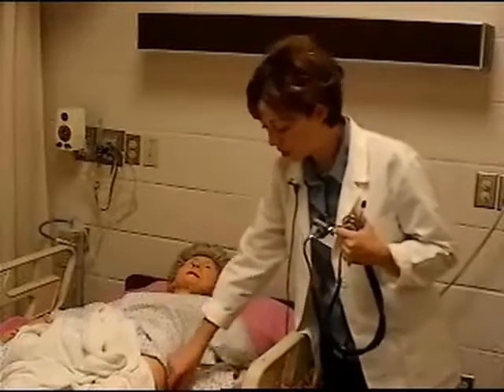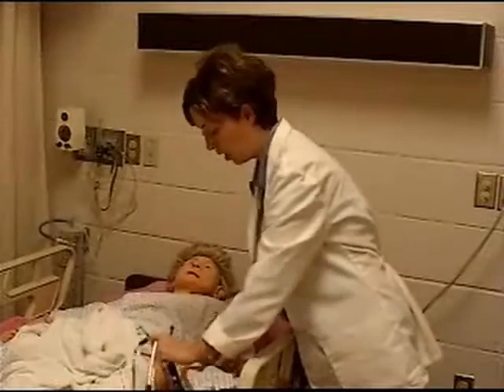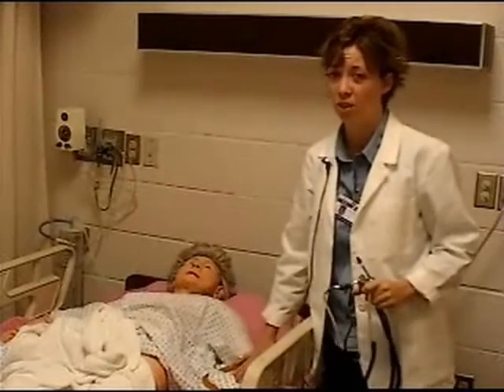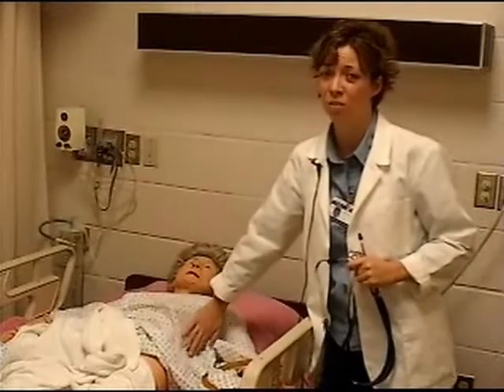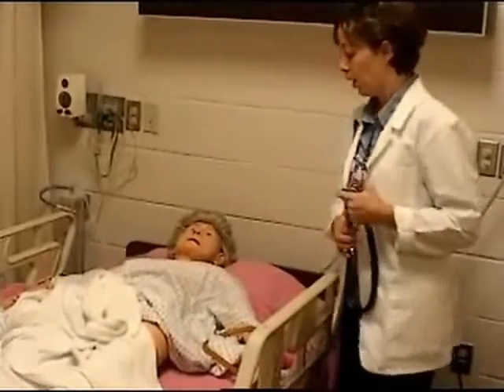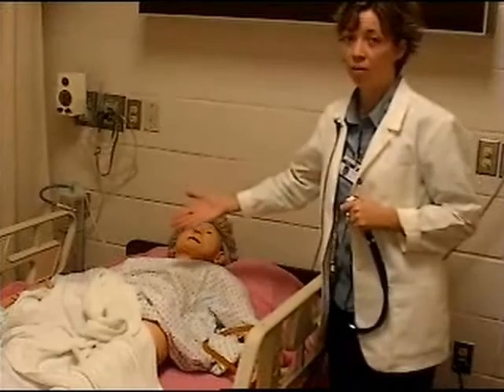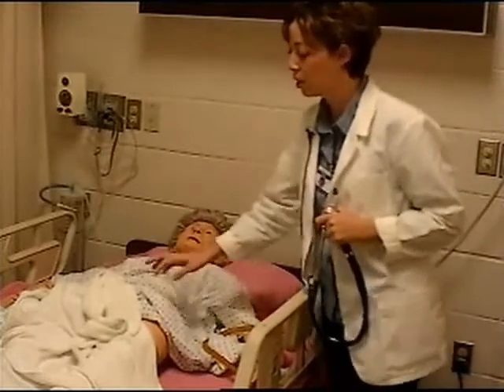When you reposition this patient and you go to sit them up, make sure that you give yourself plenty of tubing, so when you sit them up, you're not hooking that tubing on the bed and pulling this chest tube out. Nothing worse than pulling out a chest tube. The patient will be unhappy and the physician will be unhappy. So you can reposition them. They might be better to roll away from their side for lung sounds. We're just going to have to base it on how the patient is.